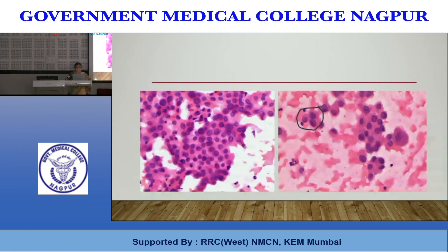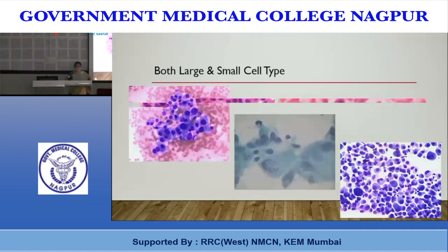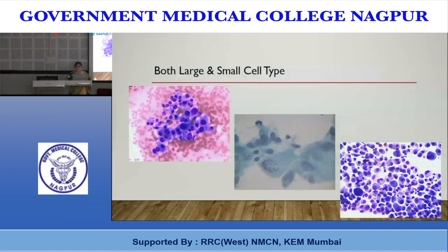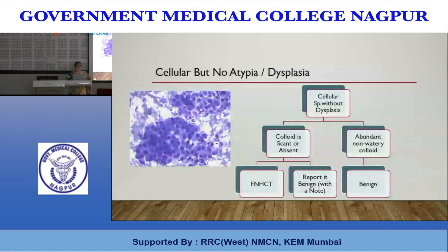Small cell dysplasia: cells are relatively small with less abundant granular cytoplasm and higher N:C ratio than usual Hürthle cells. Such sheets of cells favor a neoplasm. A neoplasm is always monoclonal and therefore shows more uniformity of cells compared to reactive conditions. At times both small and large cell dysplasia are seen together with marked variation in cell and nuclear size, and mitotic figures can be present.